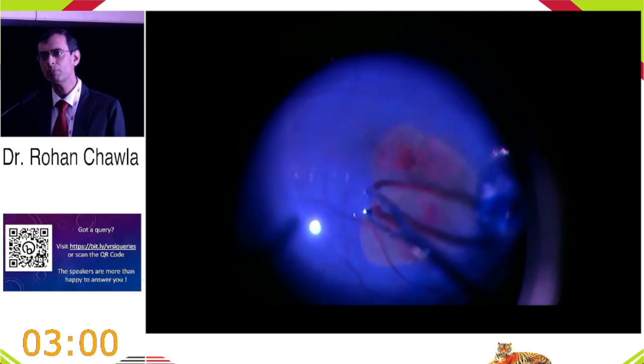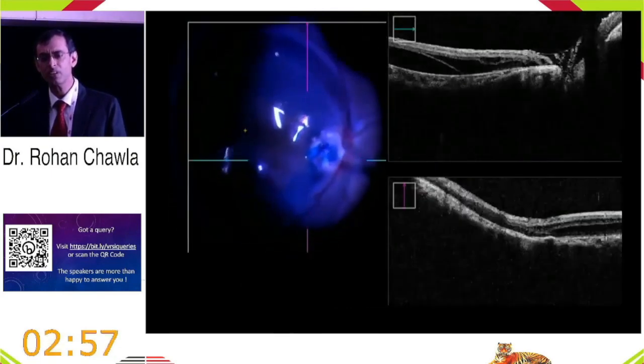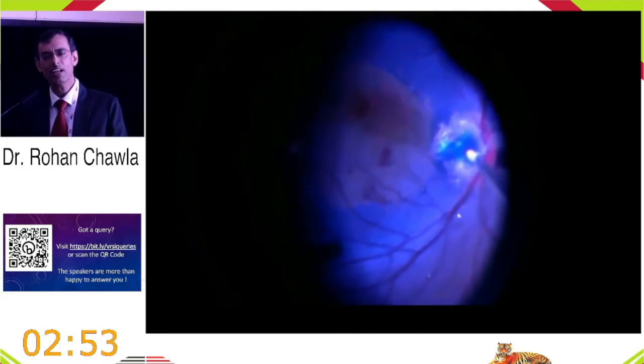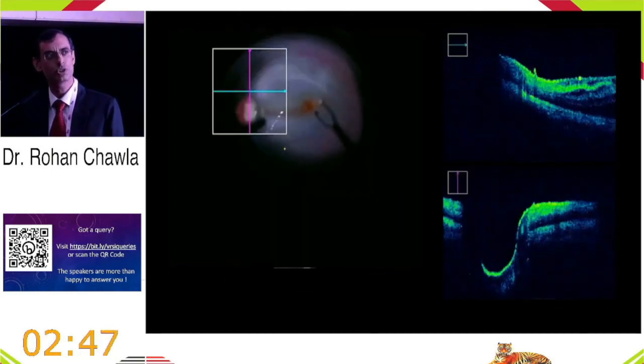This is the case of this pit. Now this information of the retinoschisis and the fluid was always there with me preoperatively, before the surgery. I'm stuffing this ILM in the pit and trying to see whether the OCT can help me place it better. But I think manually analyzing it on the microscope itself is better than what the OCT actually shows.